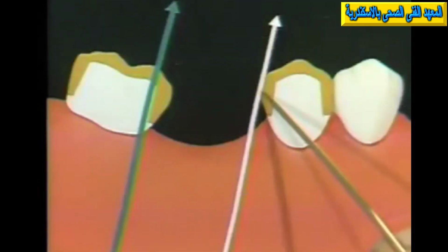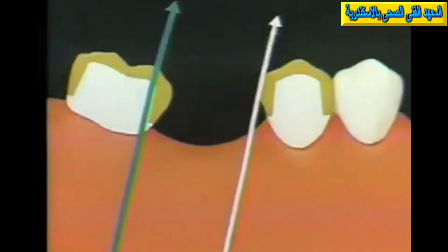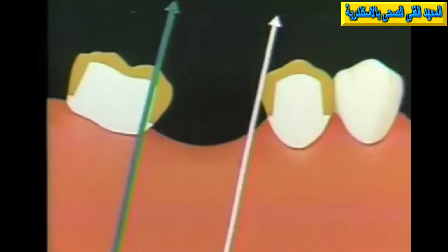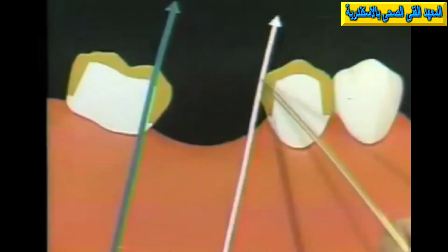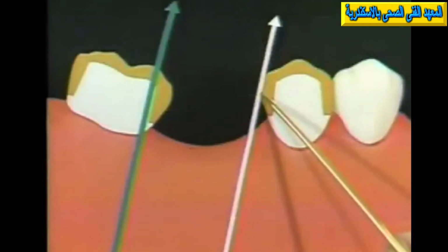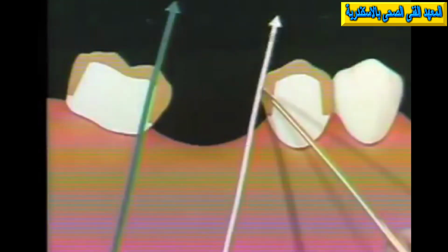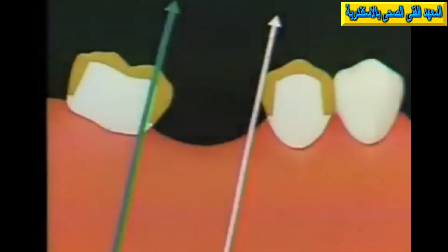If that is not done, then you may have undercuts here which would prevent the key from withdrawing from the keyway. If this needs to be a fairly extensive cut into here, as it may be if the molar is tilted markedly, then this part of the tooth needs to be rebuilt as a part of the key itself. And so the key would have this extension, the faceplate, around either side.